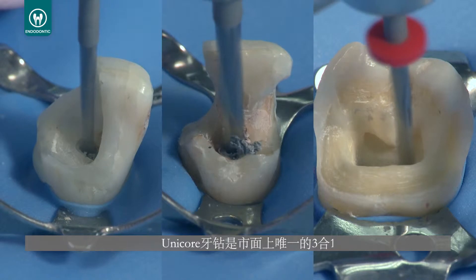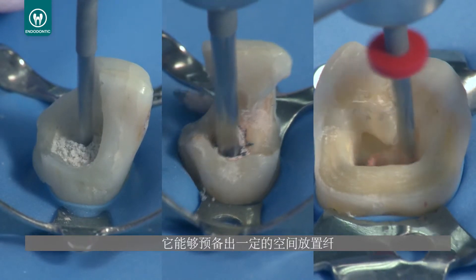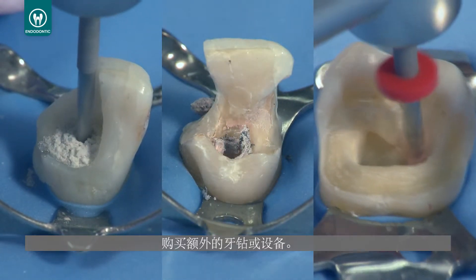The Unicore drill is the only 3-in-1 drill on the market that can create the space needed to place a fiber post and remove it for re-treatment purposes without needing to purchase any additional drills or equipment.